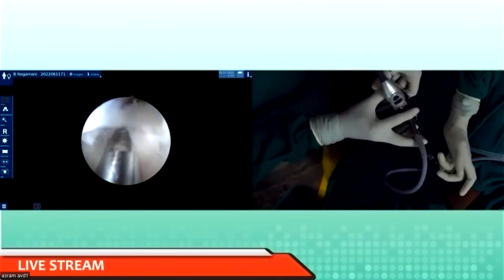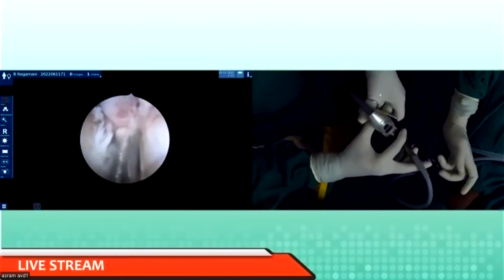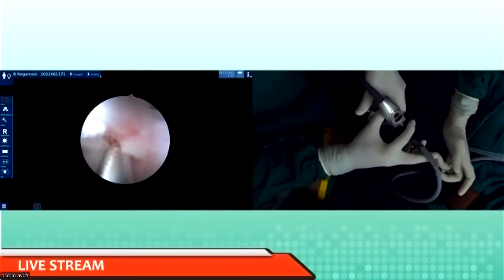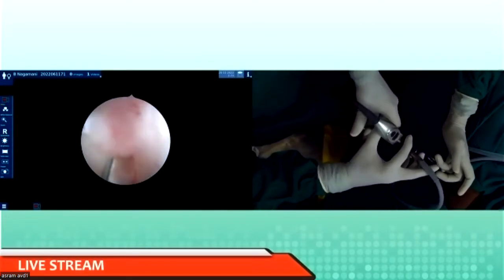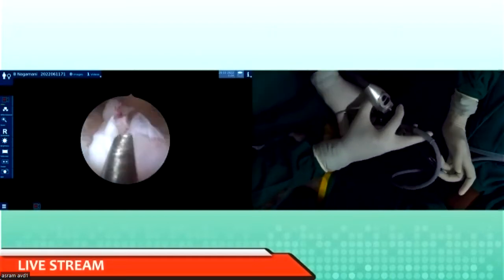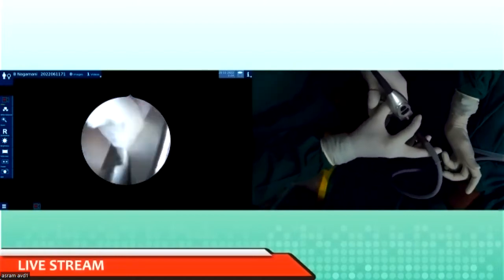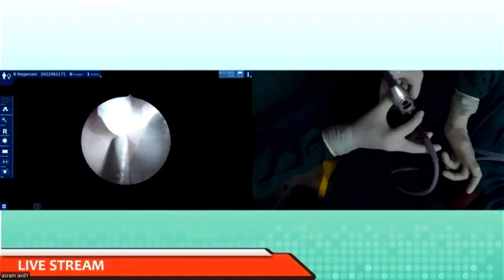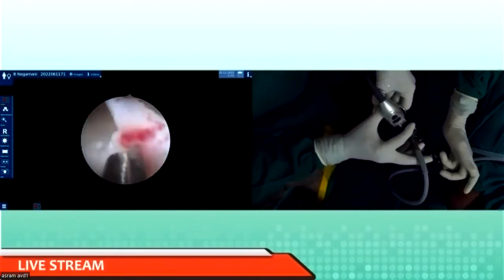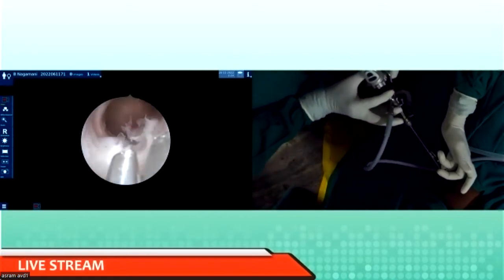So now my cable is upright and my scope is down. I am operating with the left hand. Can you see that? So this is how you cut the polyp. Probably this is what is seen as 4 mm endometrium. Okay, sir. Are you with me? Yes, sir. We are with you. Postmenopausal bleeding. Can you see that now the polyp is out?